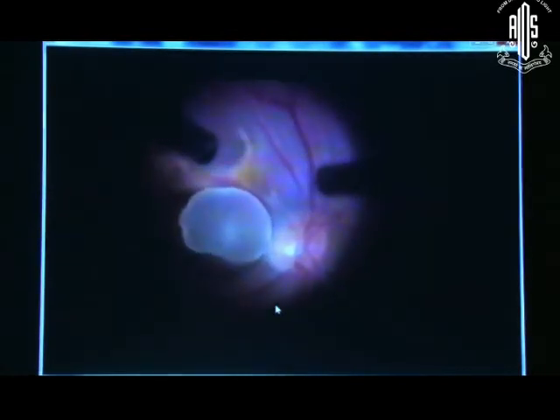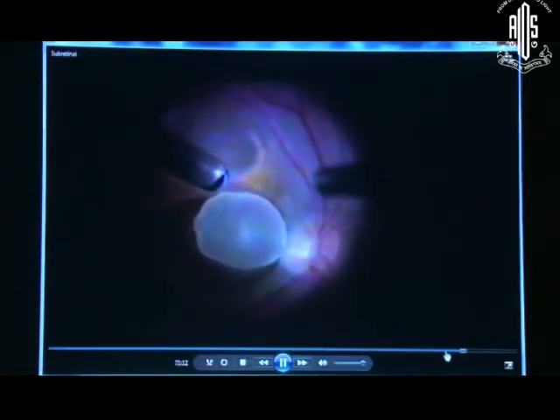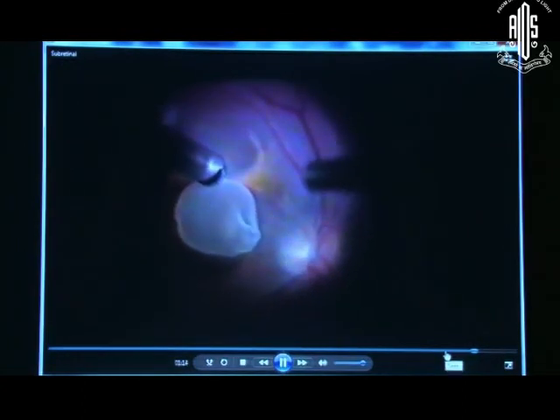The small retinotomy that we have made will need to be lasered, and endotamponade in the form of gas or oil would be a good option in this case.